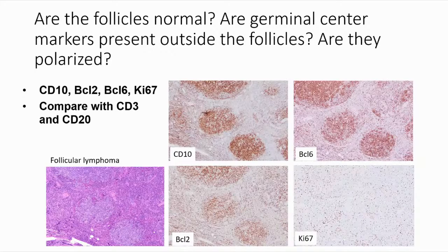And just another word on Ki67, I feel like even if I do just a slight screen of a lymph node that may look a little bit atypical.